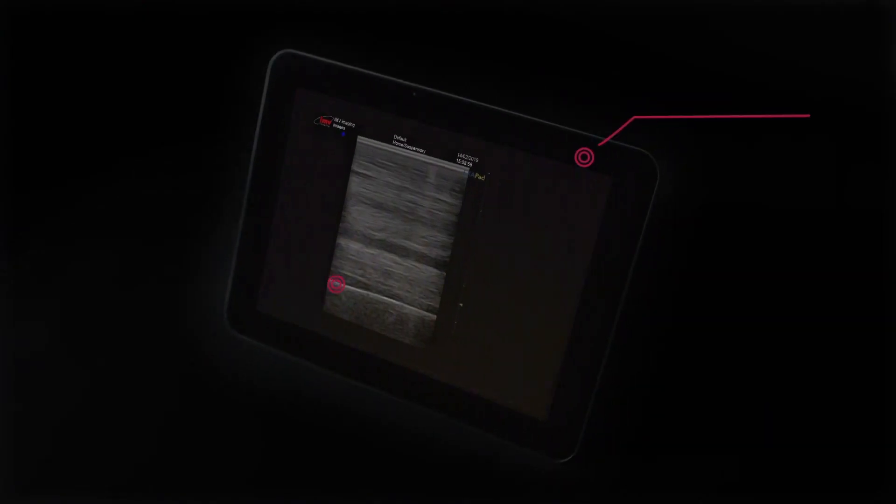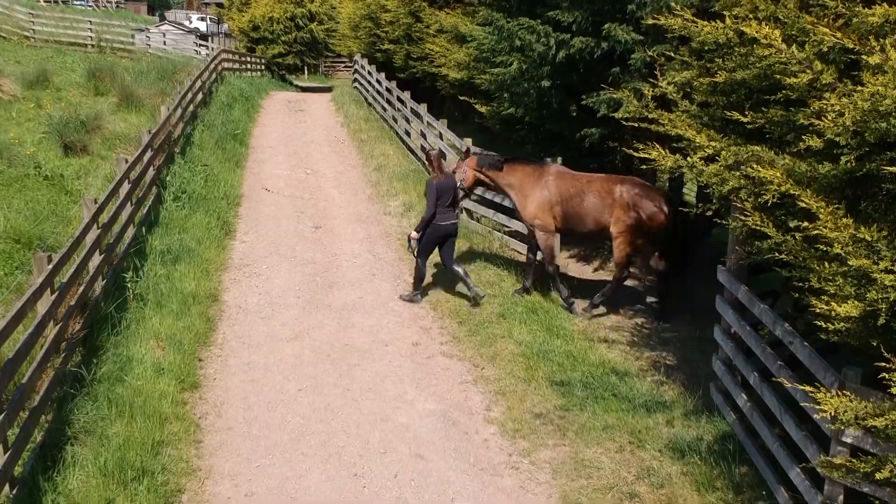Introducing the Exapad Ultrasound Scanner from IMV Imaging — putting excellence at your fingertips with an innovative design and exceptional image quality, enabling you to diagnose quickly and accurately.